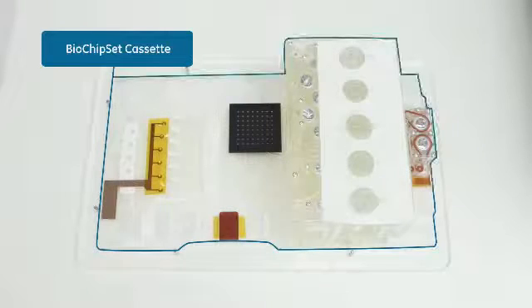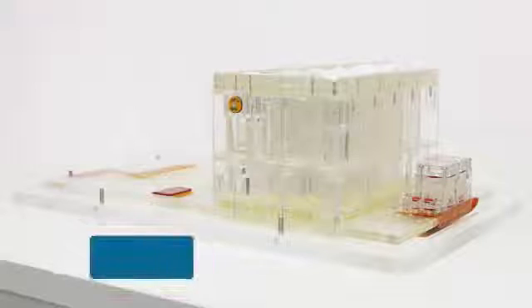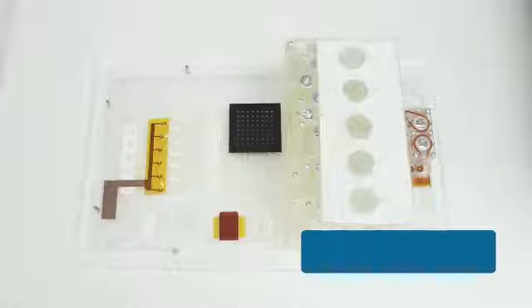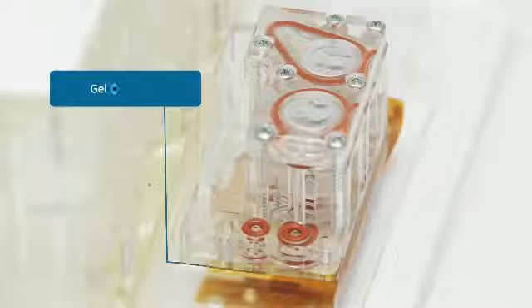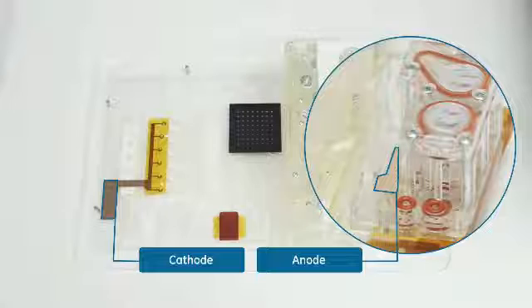The Biochip Set has multiple areas in which the steps of DNA analysis take place. Five sample chambers allow for five samples to be processed at once. The sample chambers are part of the smart cartridge, which contains all components for DNA purification. The integrated Biochip contains all of the reagents to perform PCR, and the PCR chambers are where the target DNA fragments are amplified. The gel cartridge contains the separation medium and buffer. The cathode and anode provide the electrical conductivity that drives the DNA fragments through the separation matrix.